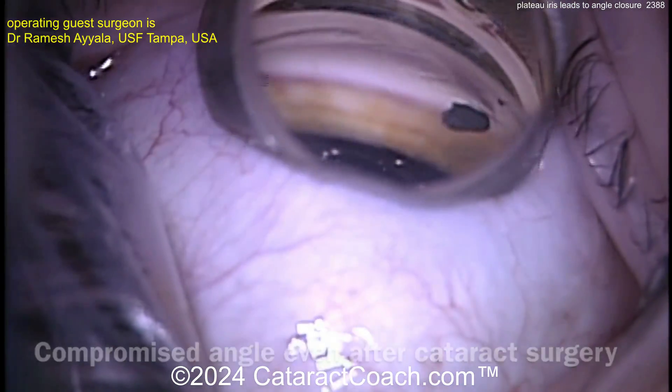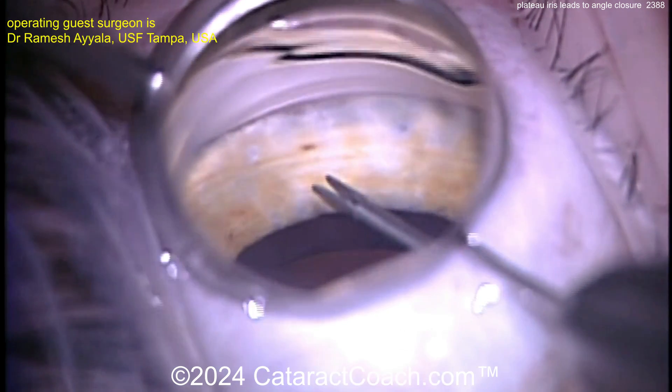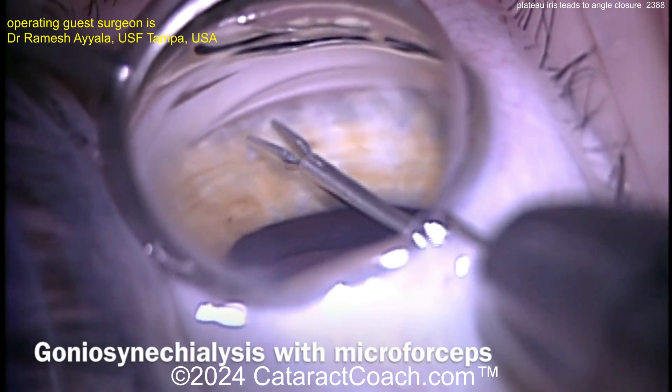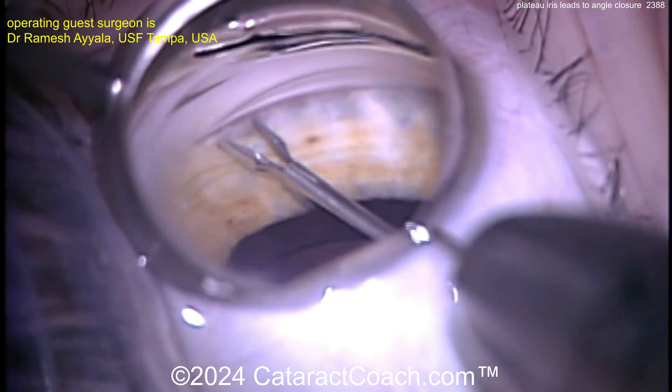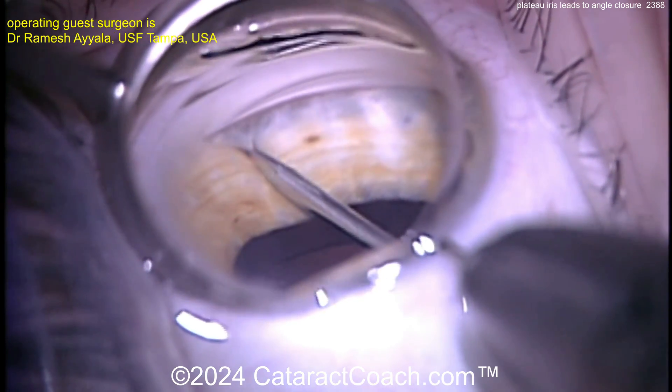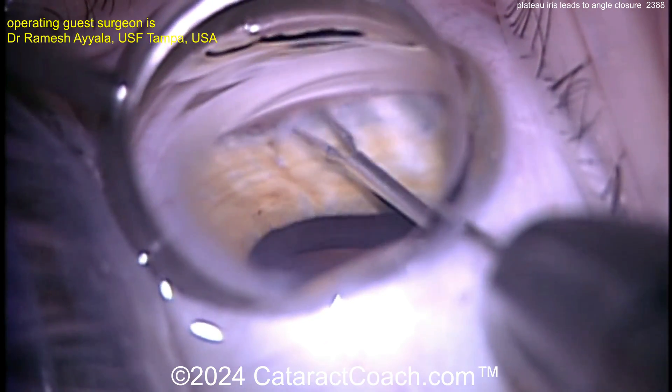FACO is already done. Now performing goniosynechiolysis (GSL), using micro forceps to gently grab the iris and pull it out of the angle. That opens the angle partially, but there are still some bumps along the iris root secondary to the prominent ciliary processes in this syndrome.